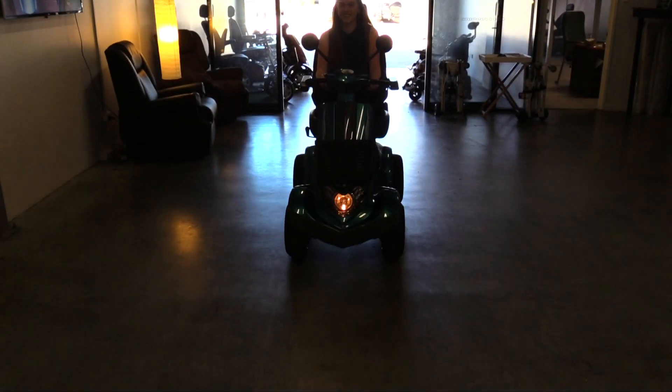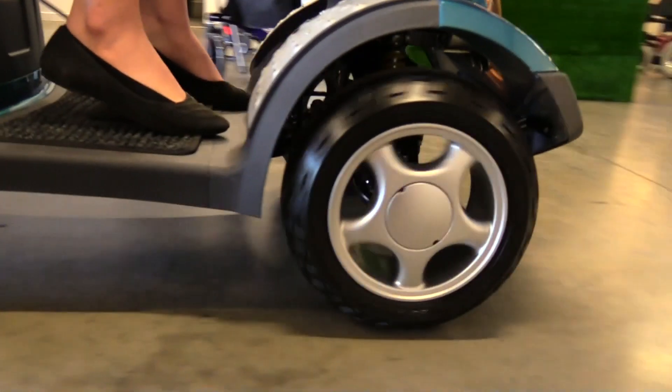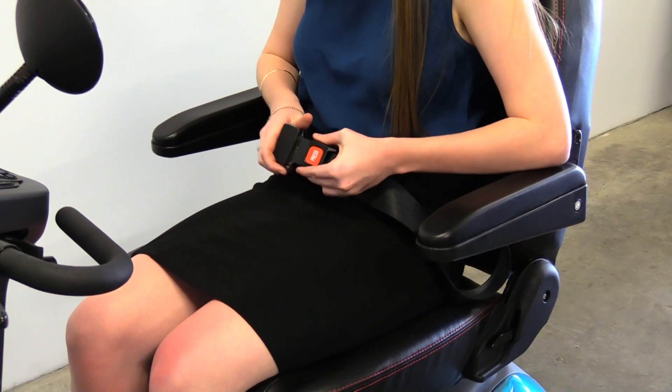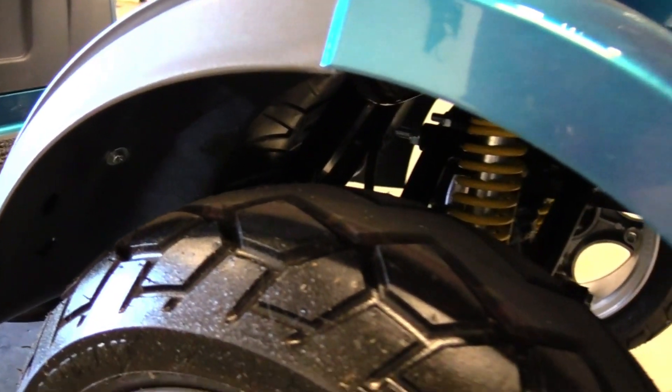Your Aviator is equipped with an automatic electromagnetic braking system. This means if you release the accelerator, your Aviator will automatically slow down to a stop. It also features an adjustable seatbelt, swivel seat, and double wishbone suspension.